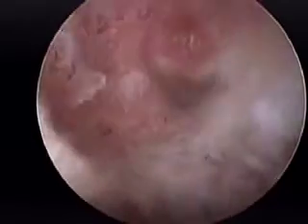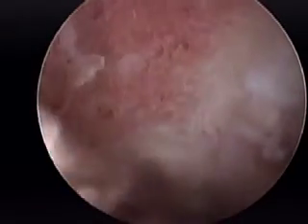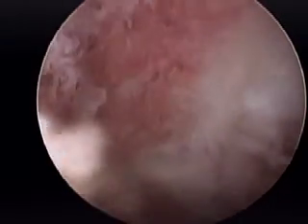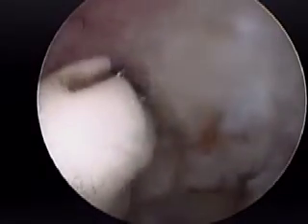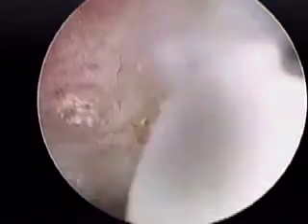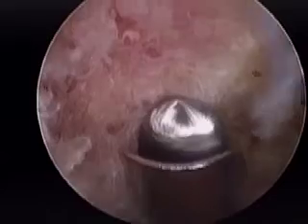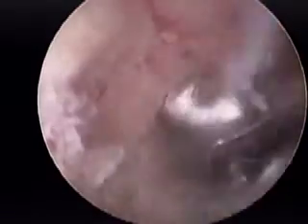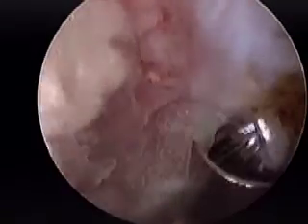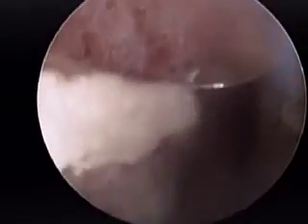So now we are removing the camera from the lateral portal when entering the AC joint through a new posterior portal. Now we are seeing the clavicle on the left, the acromion on the right. From the anterior portal, we are removing the capsule with electrocautery, and after that we are using the burr to remove the anterior superior parts of the distal clavicle.